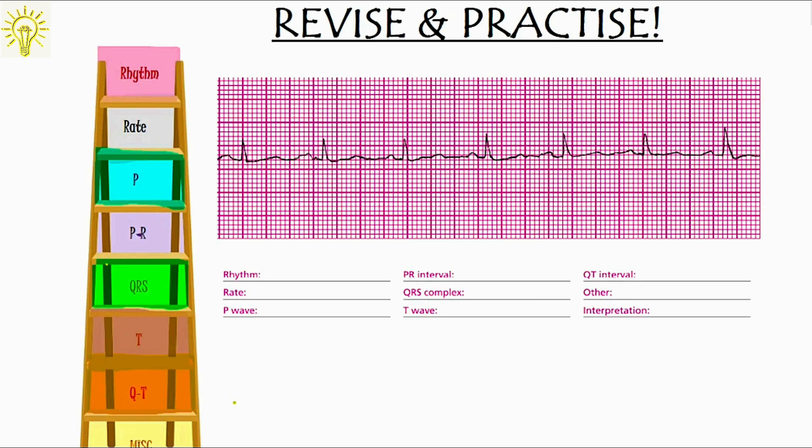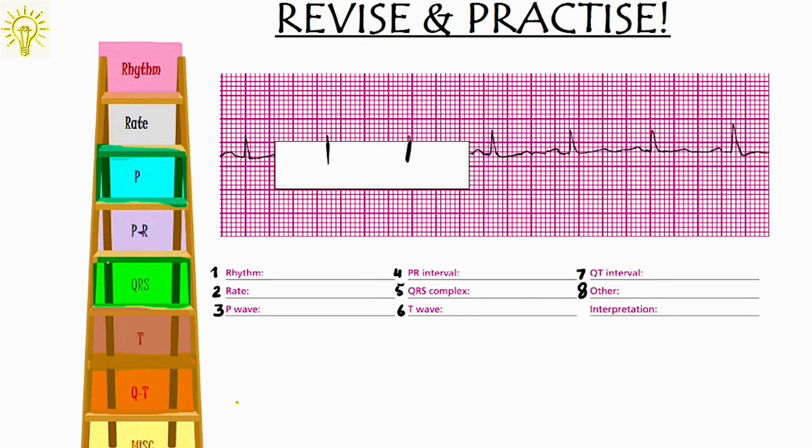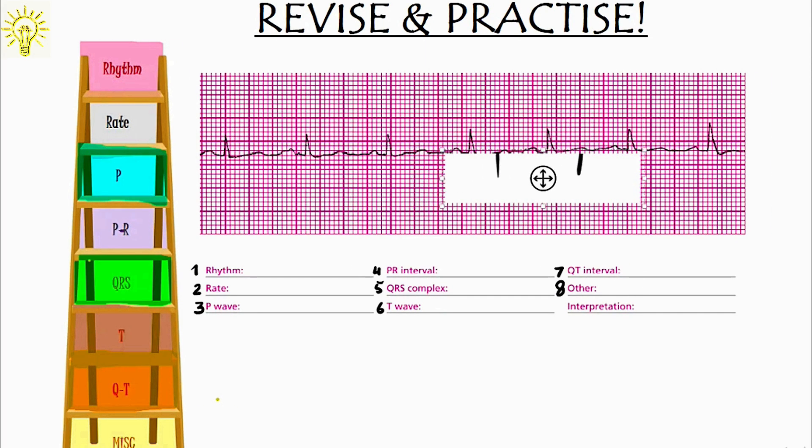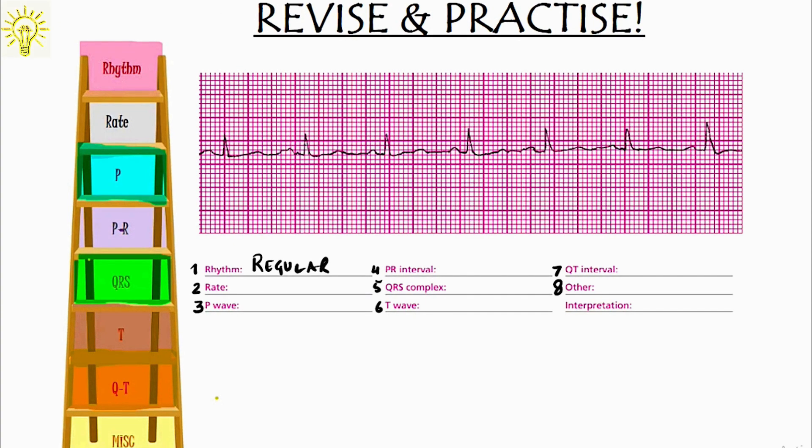Let's revise the 8 steps on this ECG strip for revision. Now remember, the more practice you do on ECG, the more you will remember. We have step 1, 2, 3 as rhythm, rate, the P wave, the PR interval, the QRS complex, the T wave, the QT interval and any other anomaly that we see and in the end we will interpret. Step 1: rhythm with the paper, we make the markings and tally with other R waves. So, all the R waves seem fine and regular. For the rate, we have 3.5 large boxes between successive R waves. So, that's around 300, 150, 100. It's approximately around 90 beats per minute.